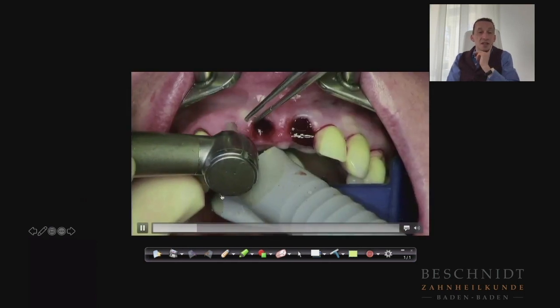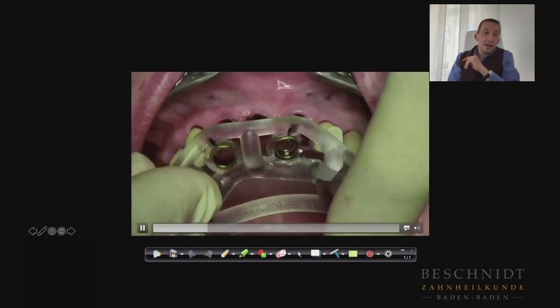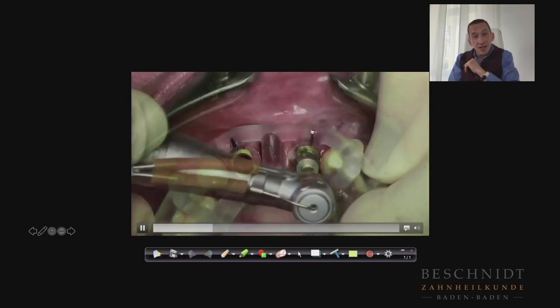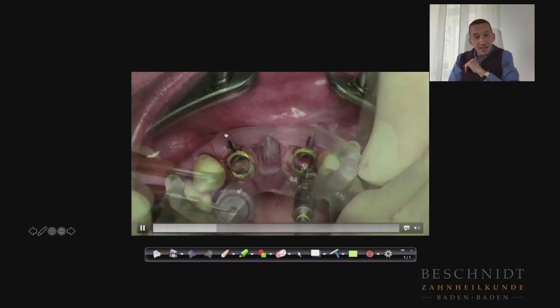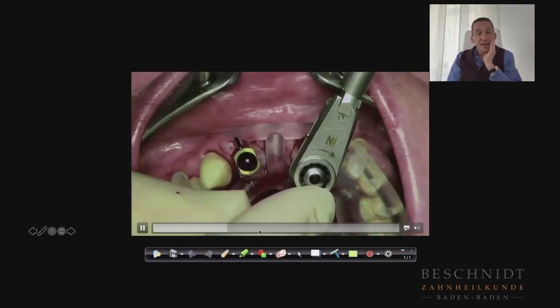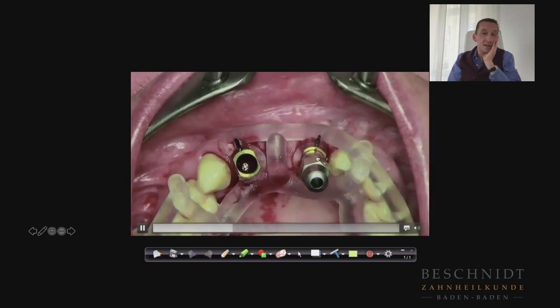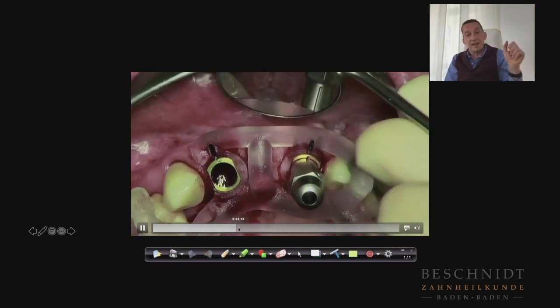We removed the junctional epithelium. And now we do the guided implant placement of 2 Conelog implants. You see the positioning index is marked on the black buccal side. Now we place both implants, and with the marking exactly on the buccal side, like the guide looks like, as you see here. This is important if you do immediate loading with the final abutments.